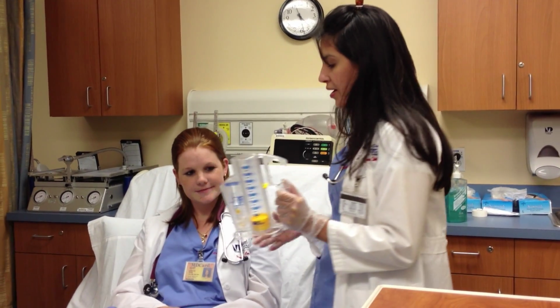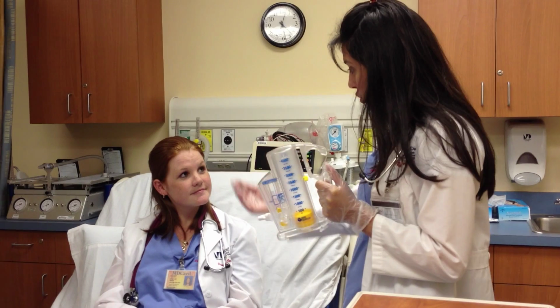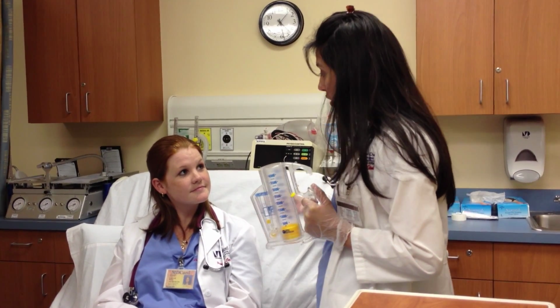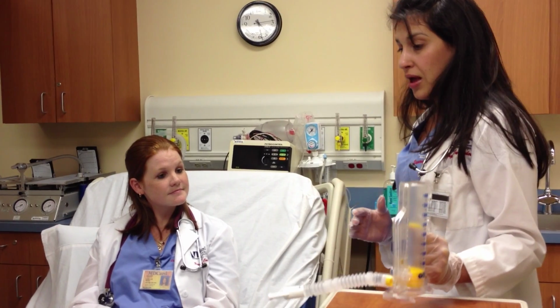Perfect. Good job. Now, this is going to be done 5 to 10 times per waking hour. And if you want, between each maneuver, you could wait 30 seconds to a minute. Since you're going to have a surgery, sometimes it's going to hurt you to cough, because I need you to cough after you've done this treatment.